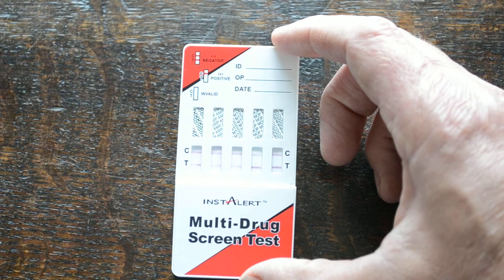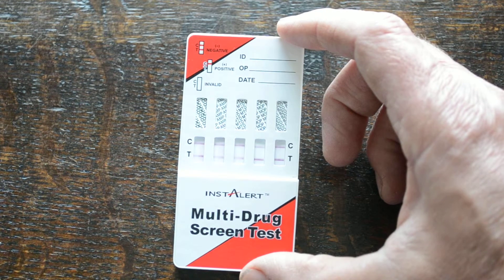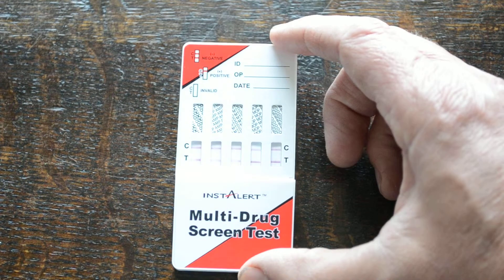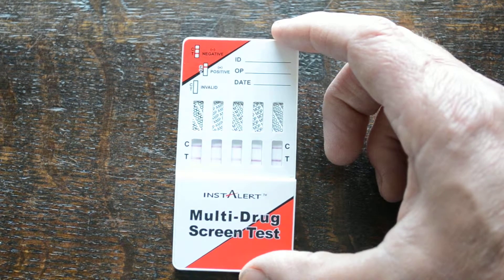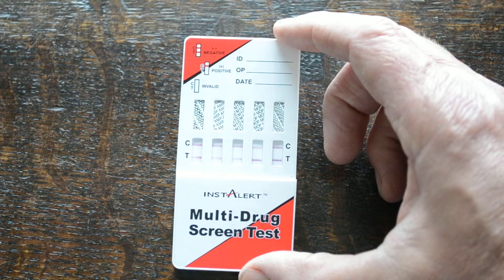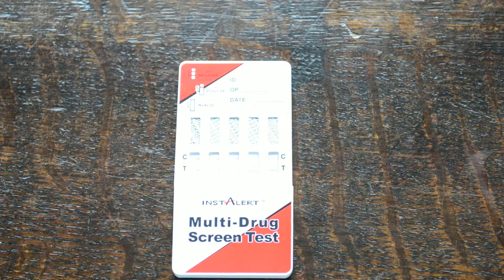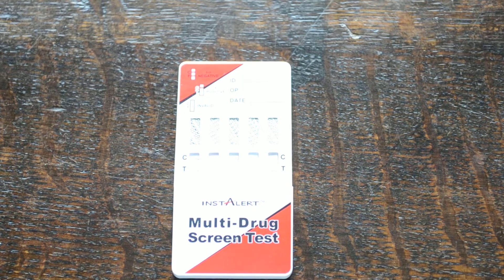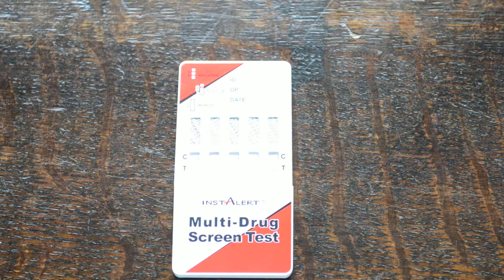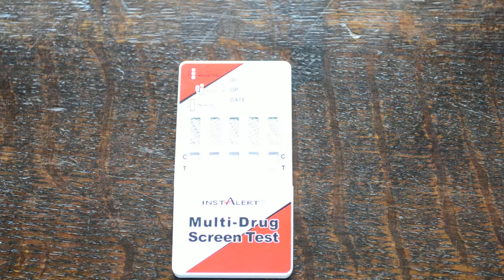Background is now starting to clear, and what we should see on this all-negative sample is five test lines and five control lines. Those test windows will continue to clear over the next three to four minutes. The read time for this test is between five and a maximum of ten minutes, but as soon as you can see control lines and test lines for an all-negative result, it's okay to move on. If you see a control line but no test line forming, indicating a positive result possibly developing, you need to wait for the full development time — any test line not showing at read time indicates a positive result.